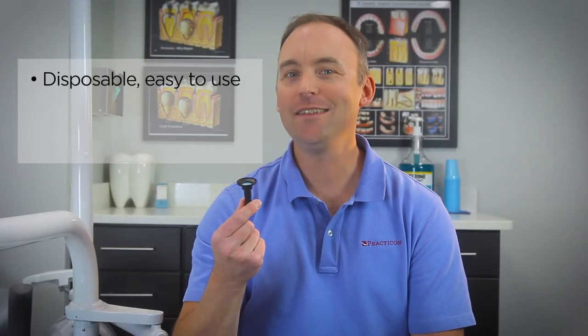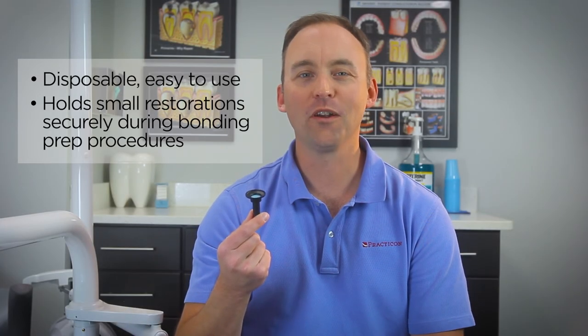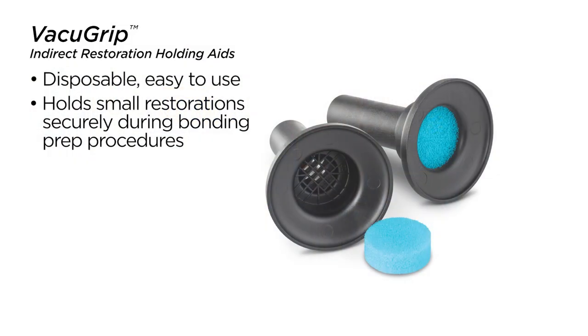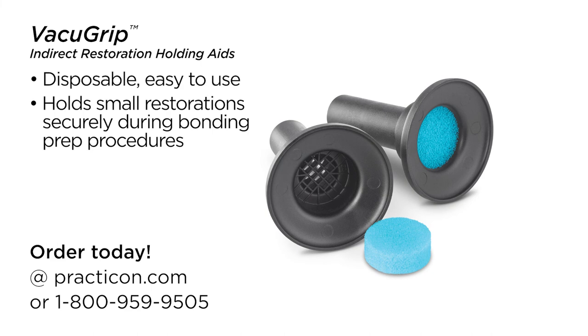The disposable, easy-to-use device that holds small restorations securely during wet or dry bonding prep procedures. That's VacuGrip, another practical innovation from Practicon.